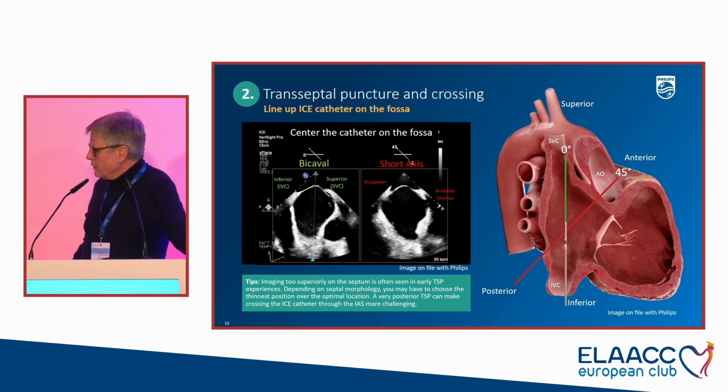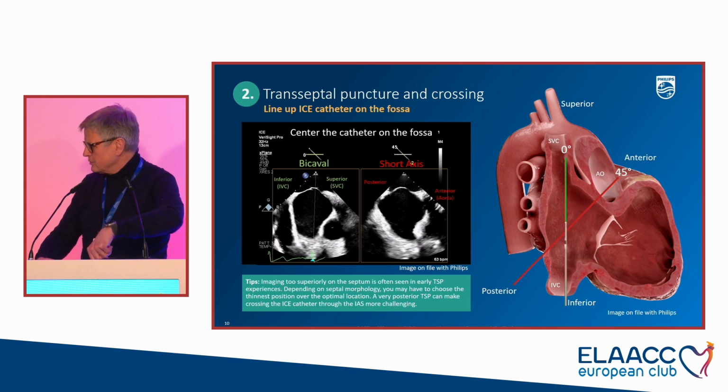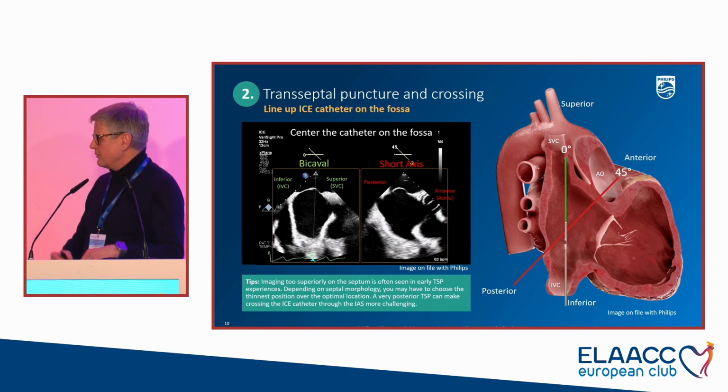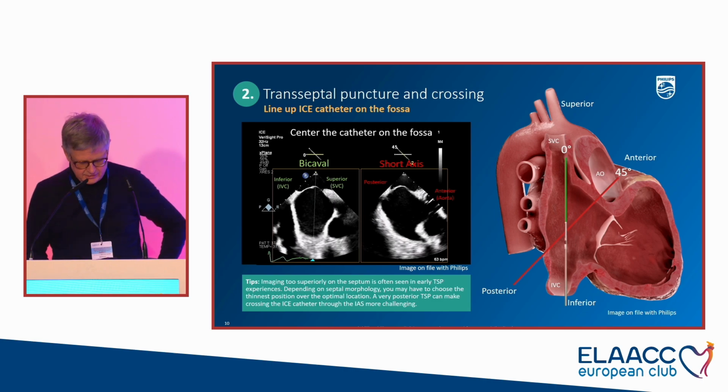As we do now, we get the septal view. We have to rotate clockwise to see the posterior part, rotate counterclockwise. Now we just keep it in the same position and we do digital steering.